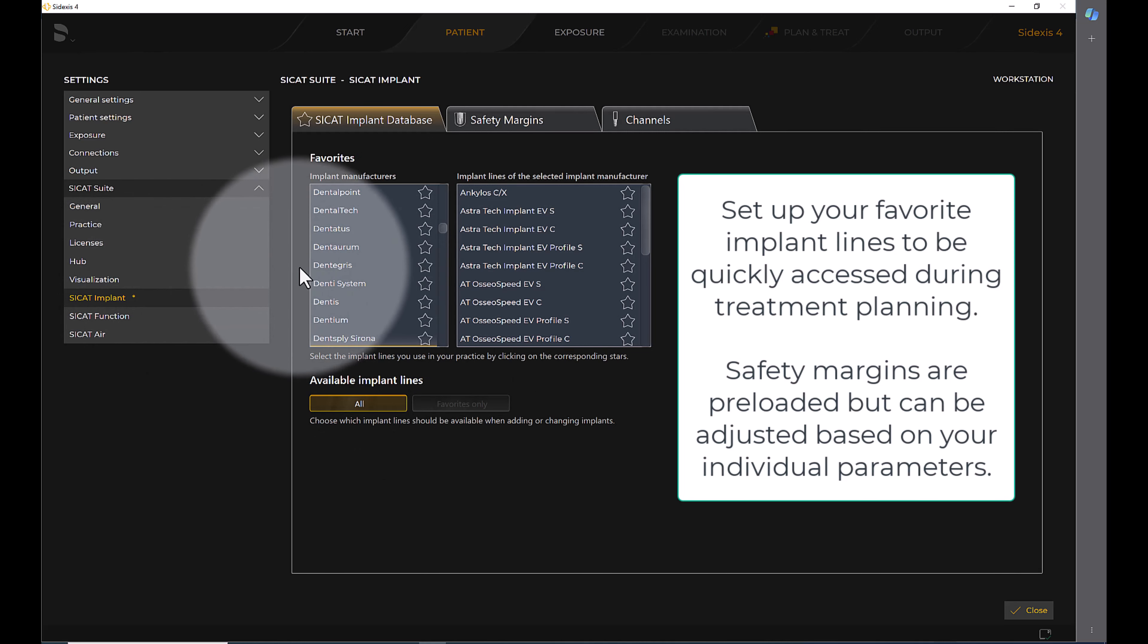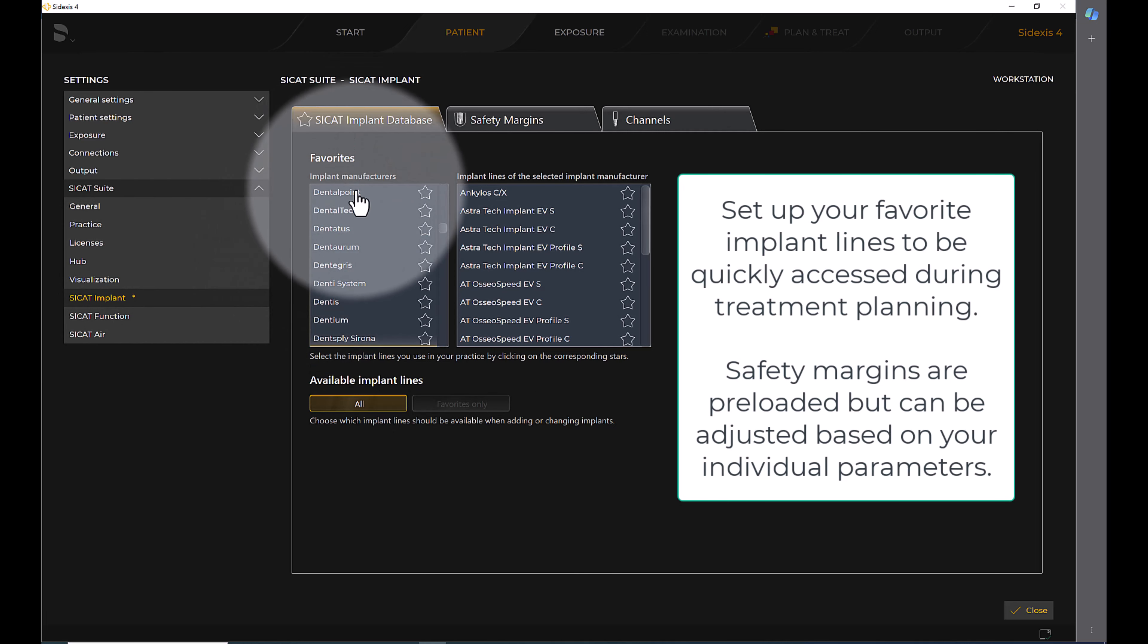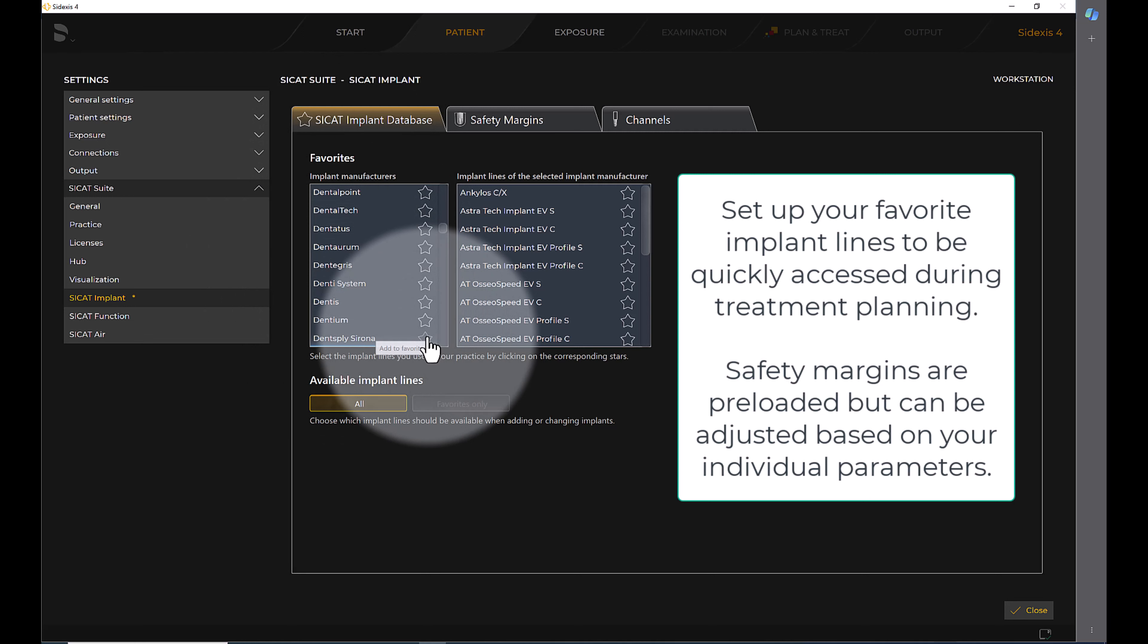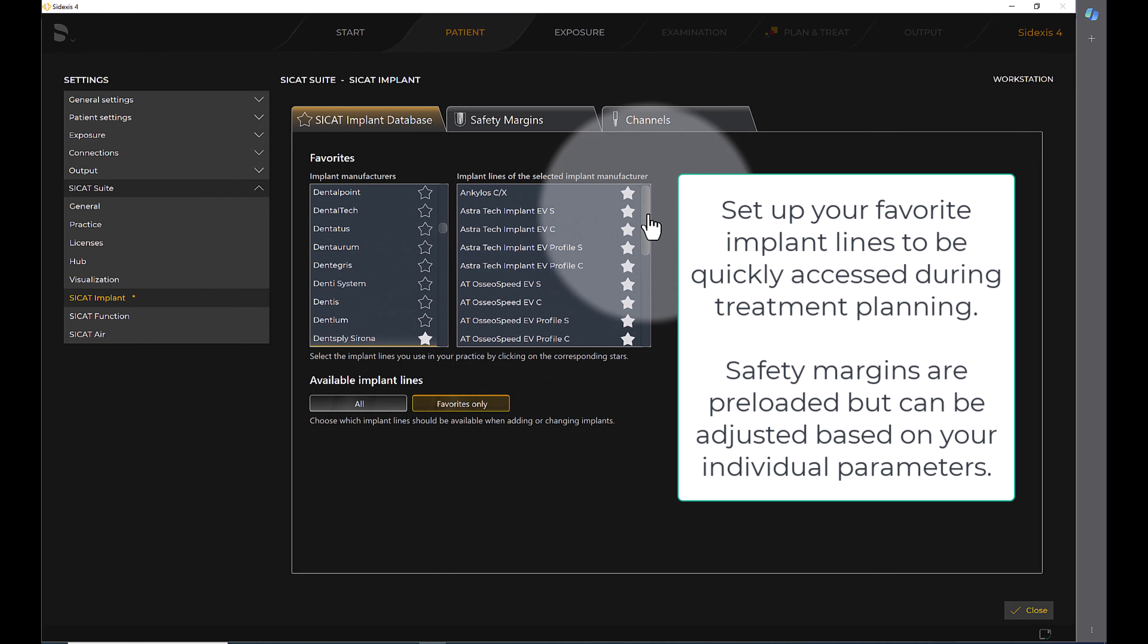Set up your favorite implant lines to be quickly accessed during treatment planning. Safety margins are preloaded, but you can adjust based on your individual parameters.